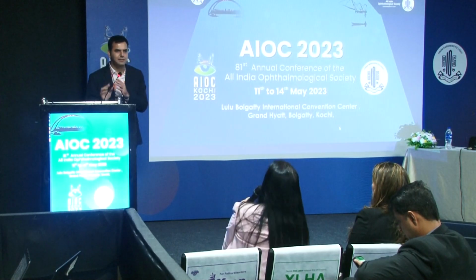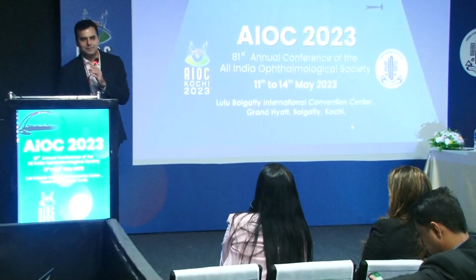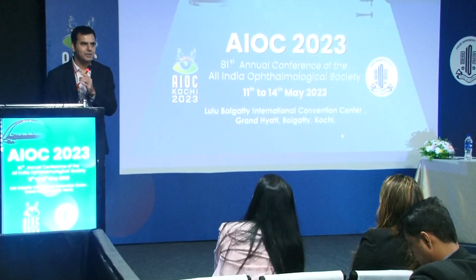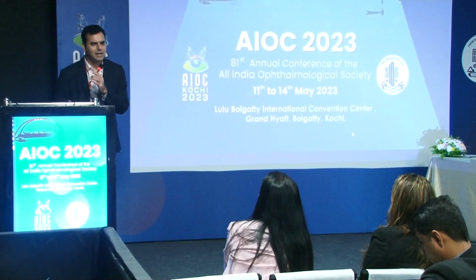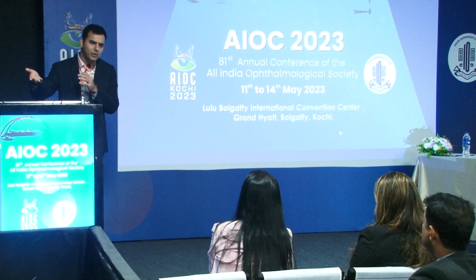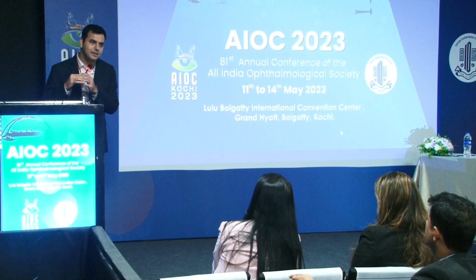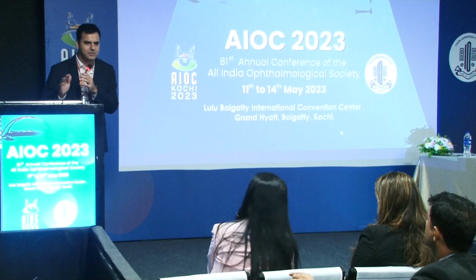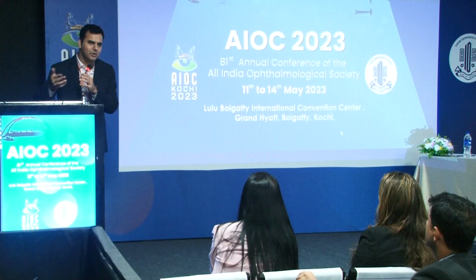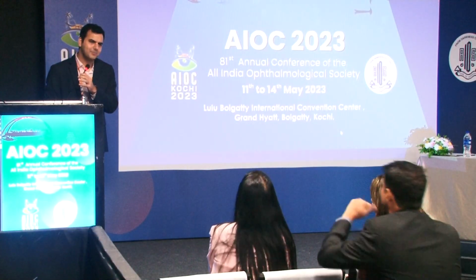Do you prefer doing bilateral simultaneous phakic IOL implantation? Never. I never do bilateral simultaneous phakic IOLs. I don't find a need for doing bilateral, because anyway I need to monitor the vault first. So you would see the vault and then place an order? No, I order both of them, because most of the time I'll end up with a pretty good vault, but I do the other eye after 1 week.